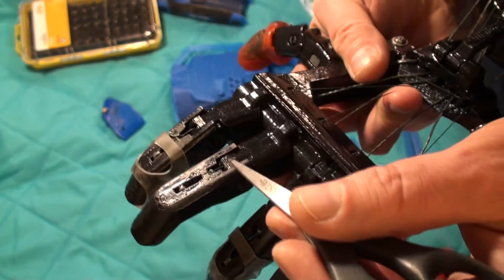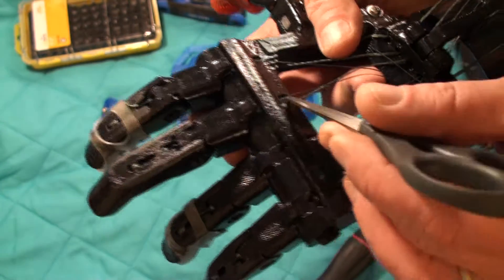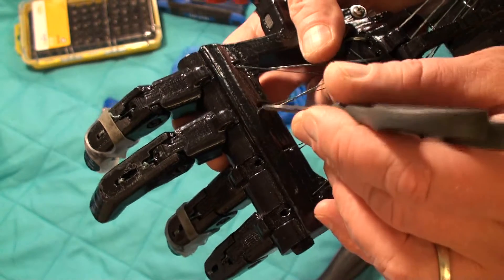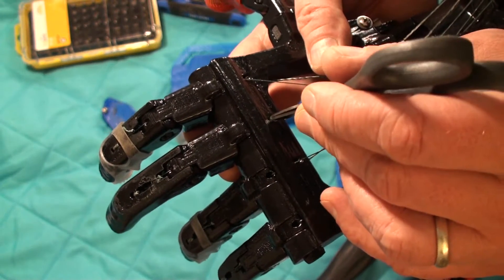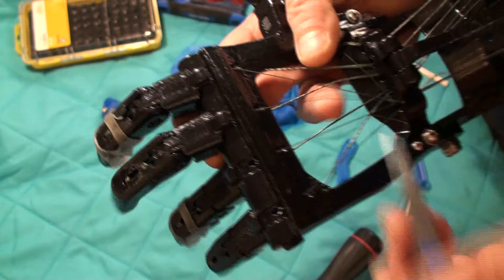The extensor goes through the dorsal channel on the back of the finger, running through the inside there, and then comes out the top holes in the palm bracket.